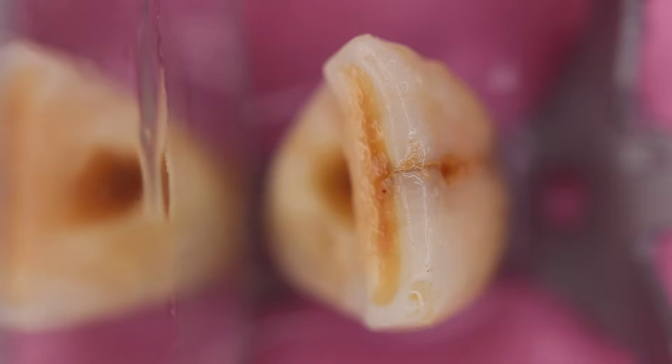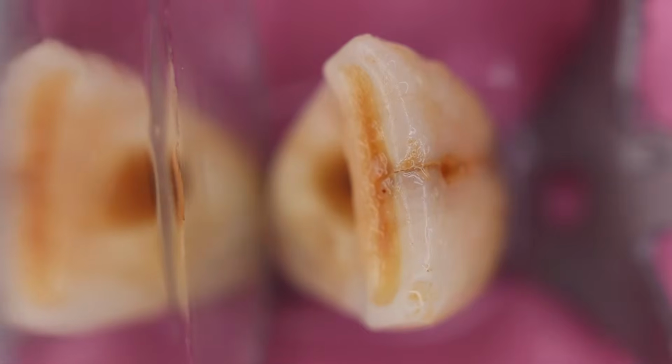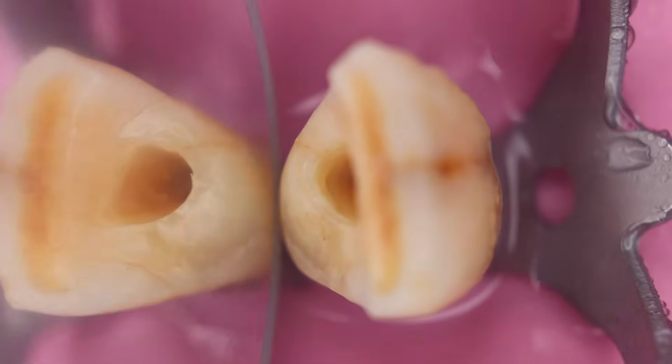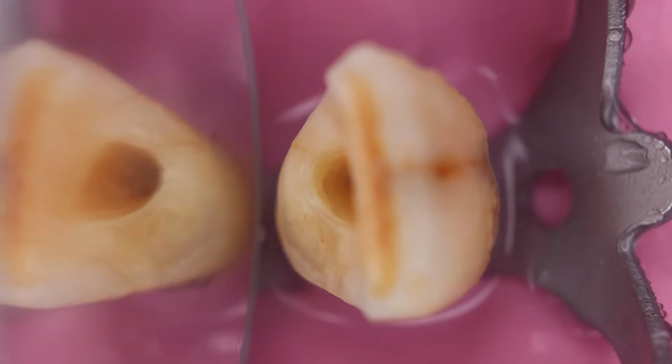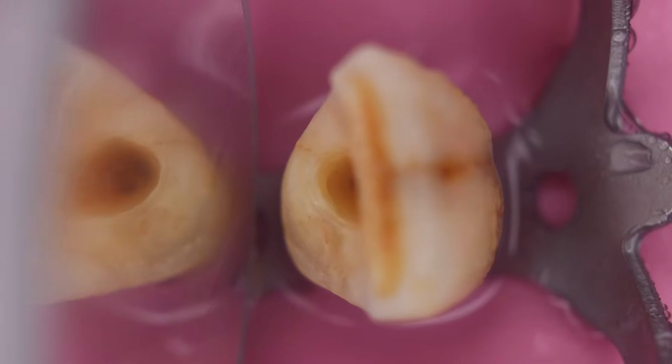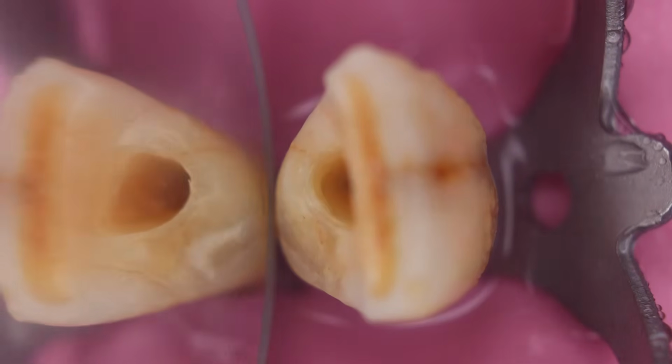So you can now appreciate that we have formed the triangular shape of the access cavity. And you can visually see the orifice.